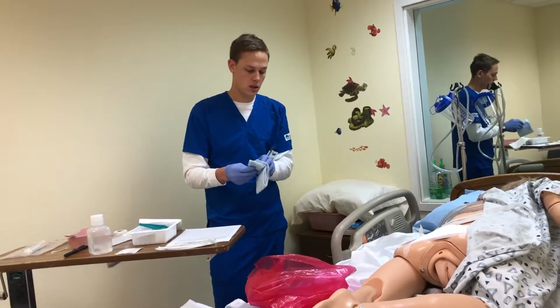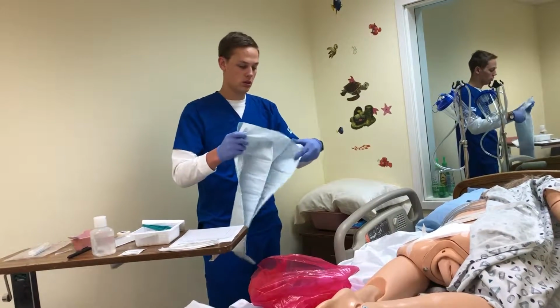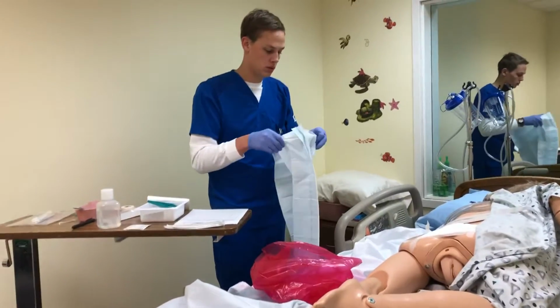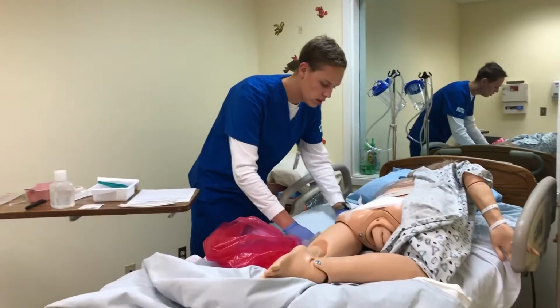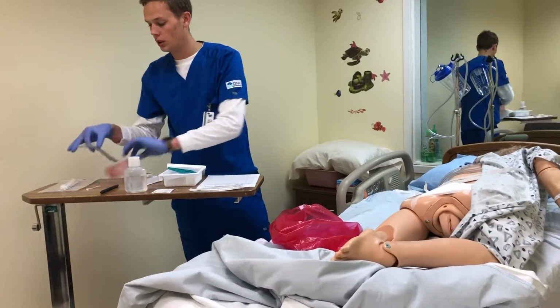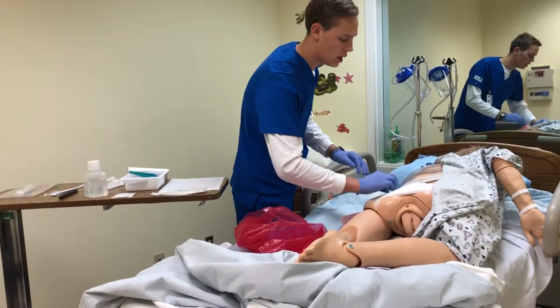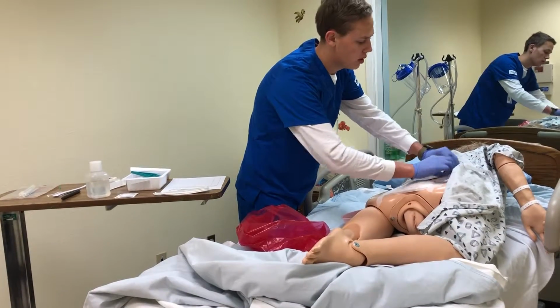Here's my chux. I'll just tuck that underneath the patient. I'll get my kidney basin here as well. Okay, so now that this is ready, I can remove the old dressing.